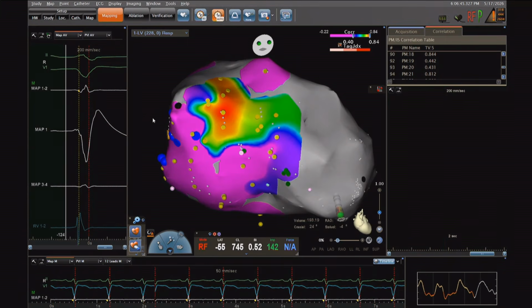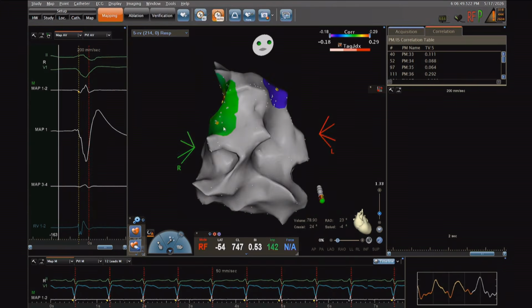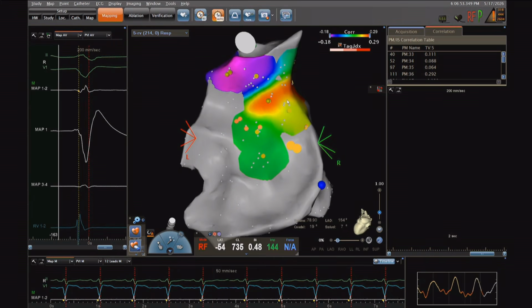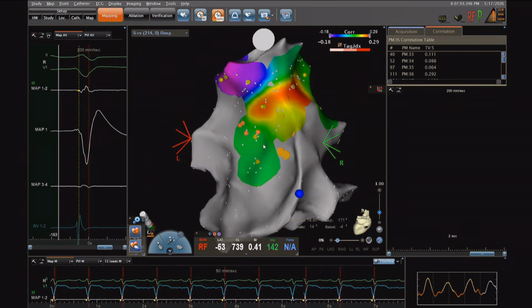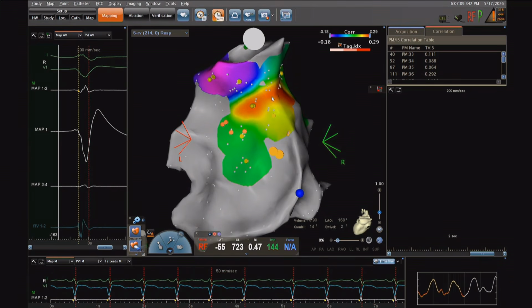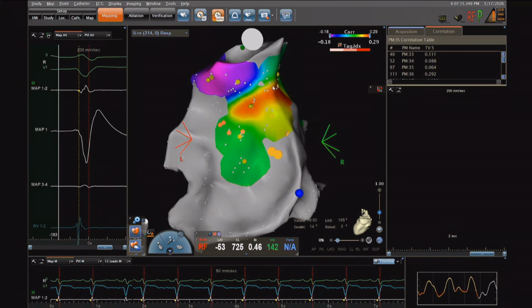So that's the reason why we moved to the right ventricle and we paced the right ventricle. So you will see it right now. And when we move all around, you see in the right ventricle, this is the septal view. The orange dots correspond to the His here. And what is above, just in front of the area where the pacing site was 84, so in the right ventricle, the best here is 30%, maximum 29 to be precise. So clearly this is not a good area.